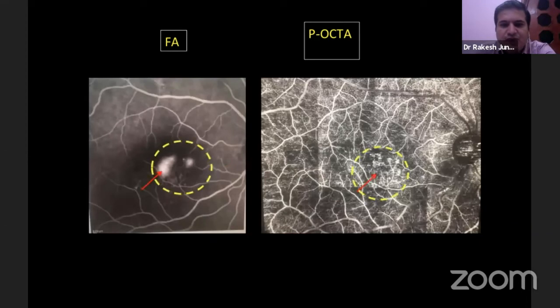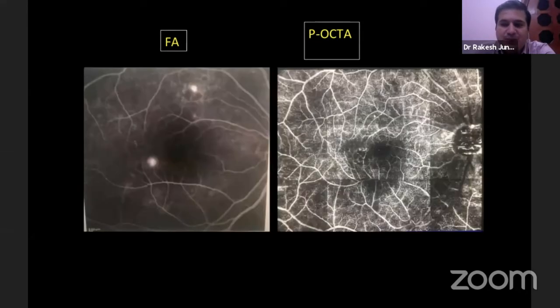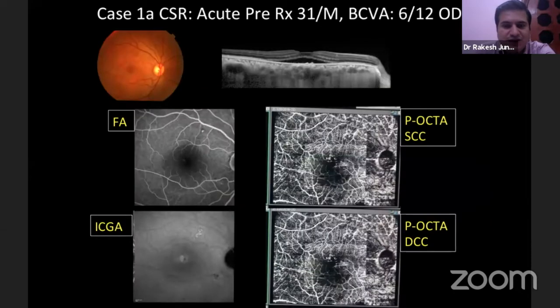Again, another frame where the areas of leakage on fluorescein very well correlate with the abnormal choriocapillary pattern identified on the panoramic OCT angiography. And again, an area of leak correlating with the abnormal choriocapillary network at the level of the choriocapillaries on the panoramic OCT angio.